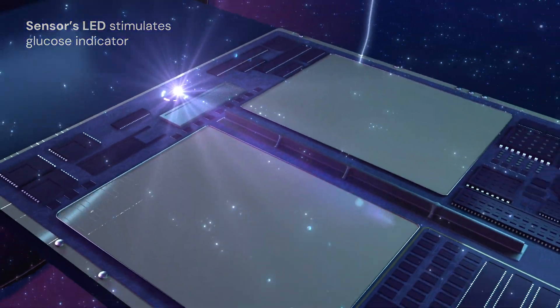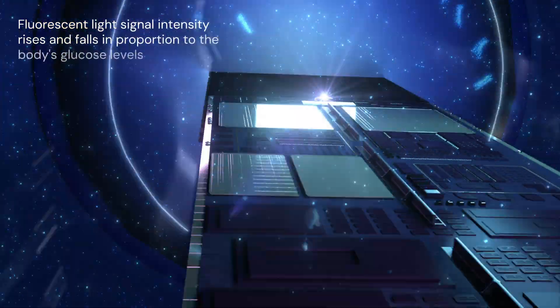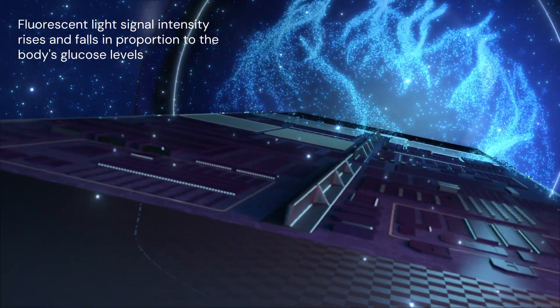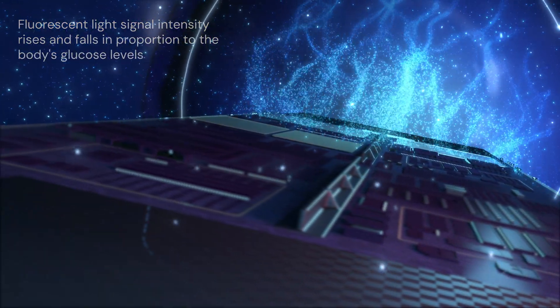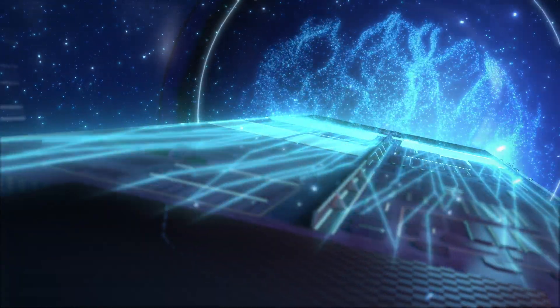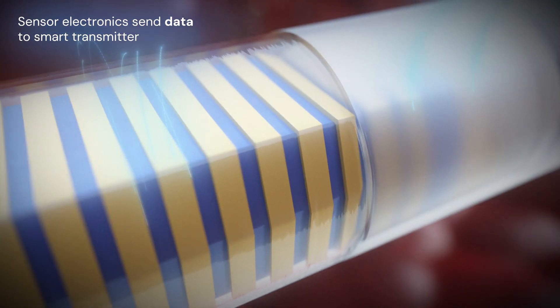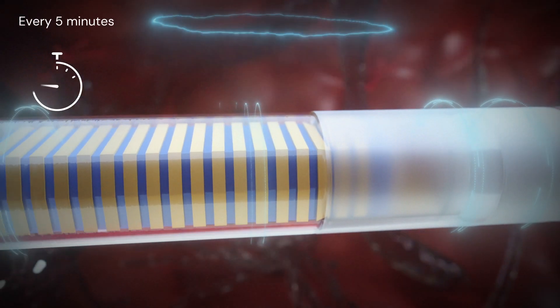The indicator molecules are stimulated by the sensor's LED and fluoresce. The intensity of the fluorescent light signal rises and falls in proportion to the body's glucose levels. Special electronics inside the sensor digitize the light signal and send the data to the transmitter every five minutes.